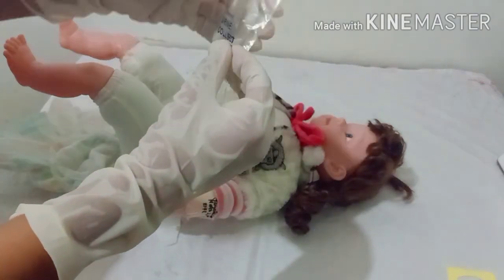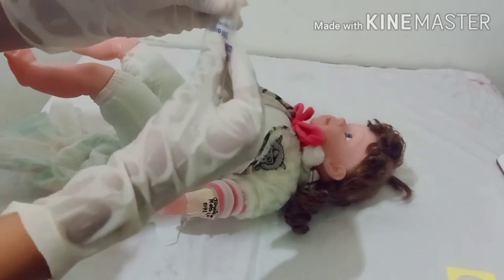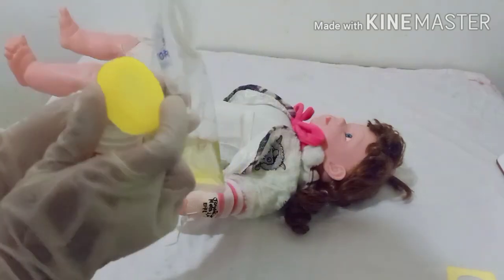Fold the two adhesive surfaces together and seal the bag or transfer the specimen to an appropriate container.